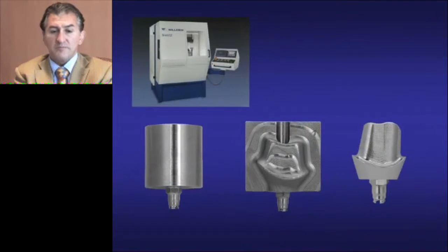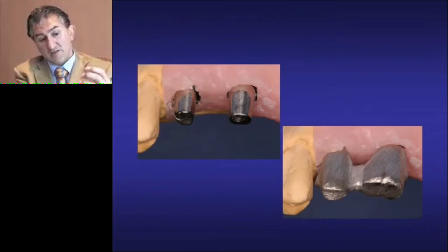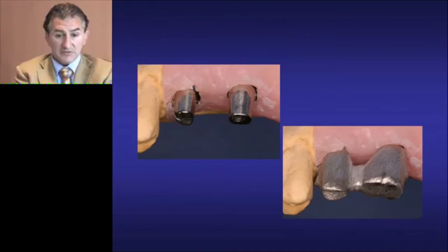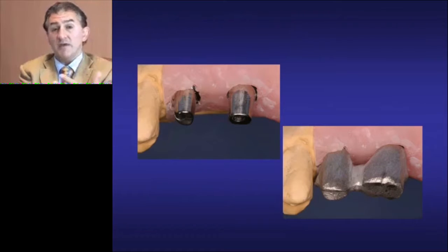And in one part of the facility, the Encode is fabricated from the milling machine. It takes about 15 to 20 minutes to mill it out. And in the other part of the facility, the analog is placed. So at the end of that assembly line, the abutment and the analog are placed together, and that's returned to your laboratory. When your laboratory gets it, they make a provisional that we've requested, and then they make the casting, or the PFM casting, or the zirconia coping, depending on what you've asked for.